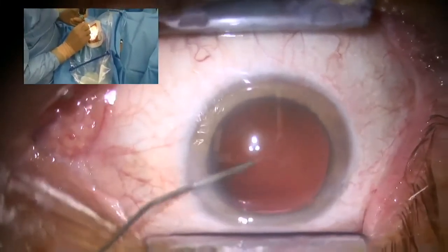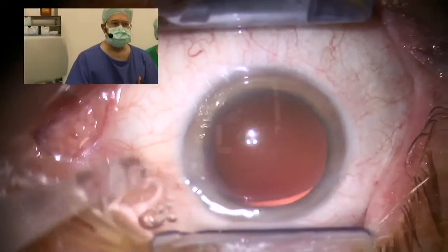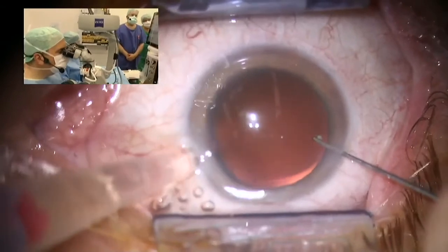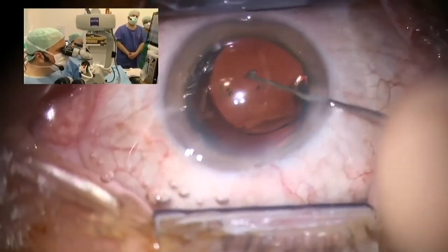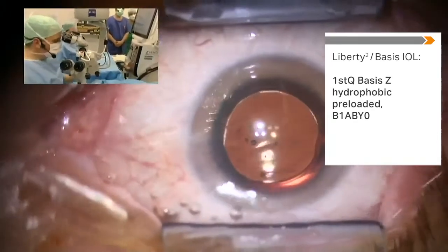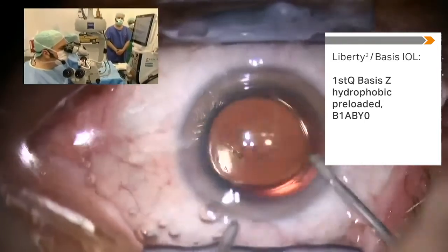Your nanolaser technique seems to be very advanced. Do you find any differences between phaco and the photofragmentation at this stage of your use of this system? Yeah, when colleagues are visiting us in the OR, I always tell them that my approach to the new technique is not to explain it as another kind of phaco. You have to listen to the interaction between the laser and the tissue, and it is different. It's not another kind of phaco.